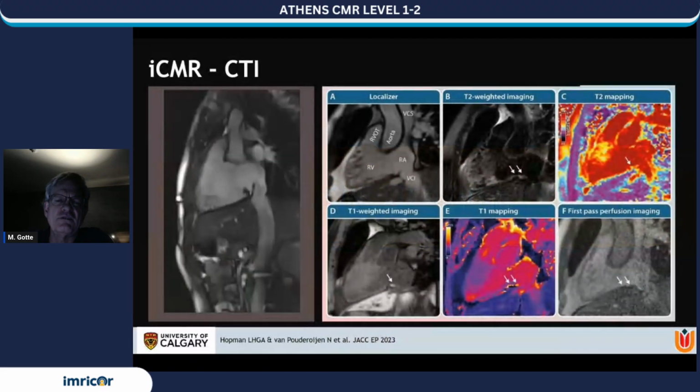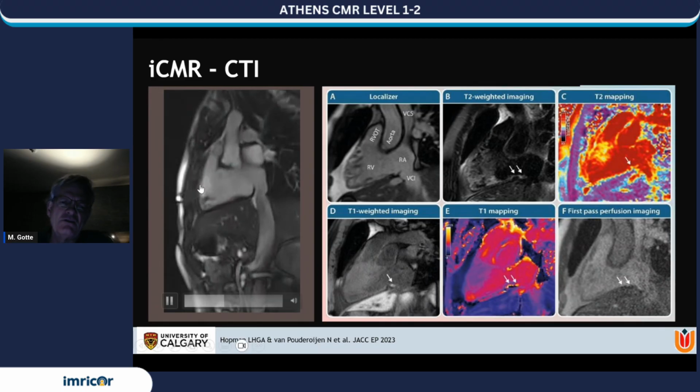We have done a lot of flutter cases like other sites have shown. That's important. You cannot start doing complex procedures before you have a team practicing the procedure. I show this image because there was a discussion, driven by electrophysiologists who admit that the ablation of a lesion or location is tough because of the deformation of the heart. And this image shows you clearly the deformation, the stretching and shortening of the isthmus where you intend to ablate.